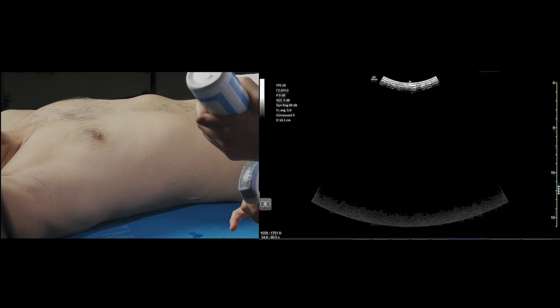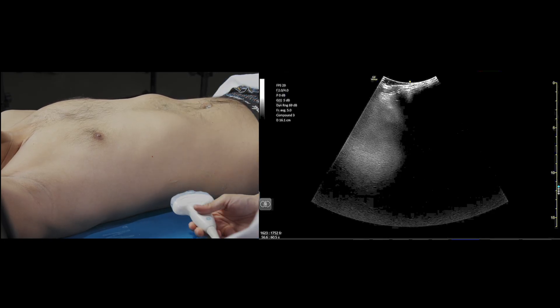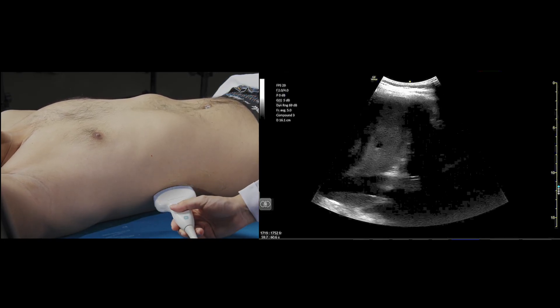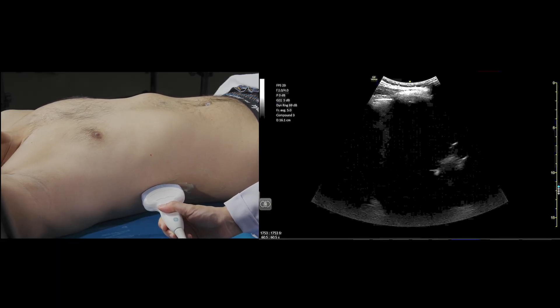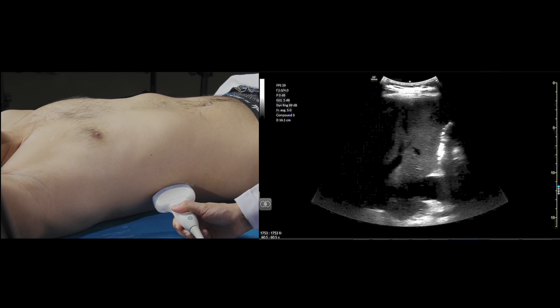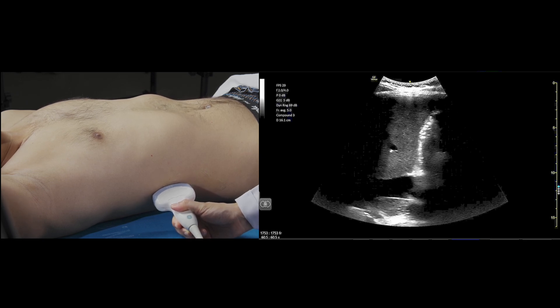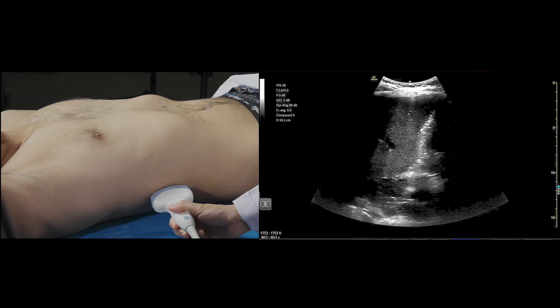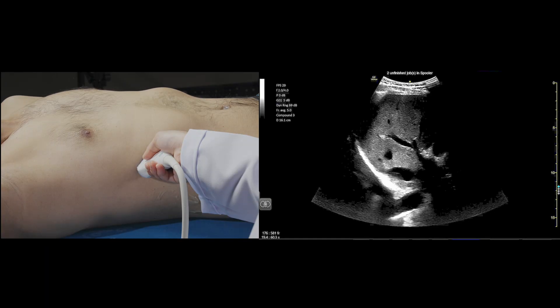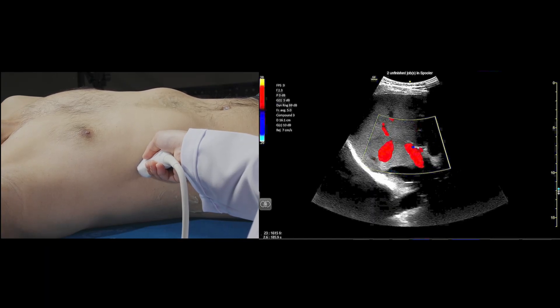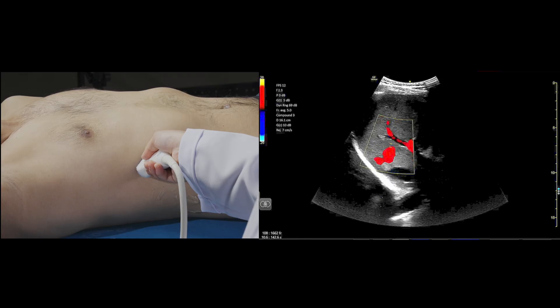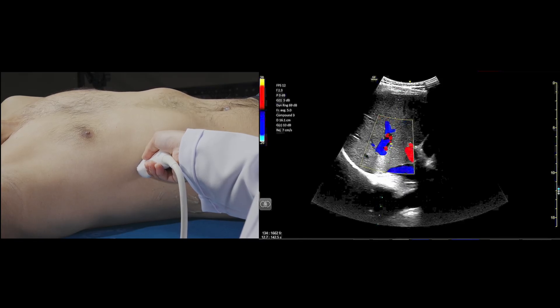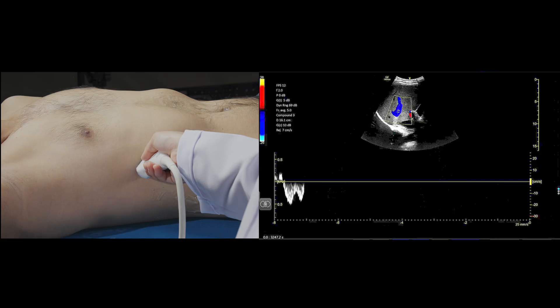In the coronal view, we place the transducer at the junction between the xiphoid process and the mid-axillary line, with the orientation marker aiming towards the patient's right axilla. We can slide the probe slightly towards the patient's head to visualize the liver-diaphragm interface, then tilt the probe downward slightly to visualize the hepatic vein draining into the IVC. We put color flow on to see the blue color, identifying blood moving from the hepatic vein away from the transducer and into the IVC.